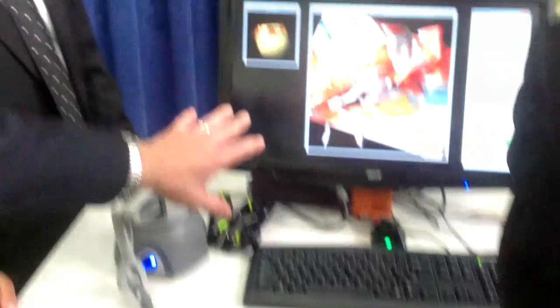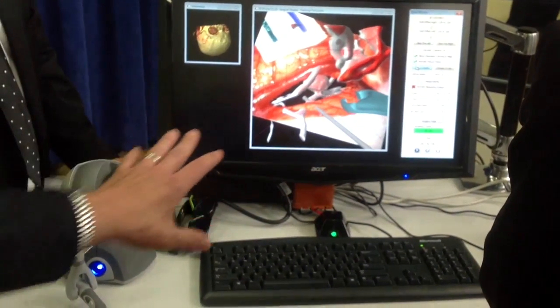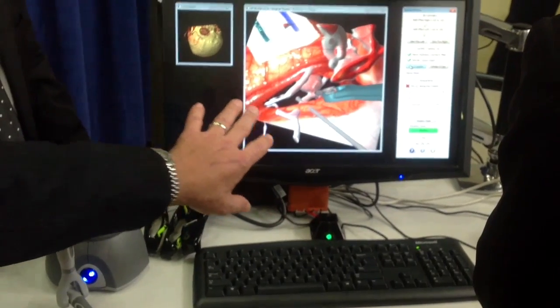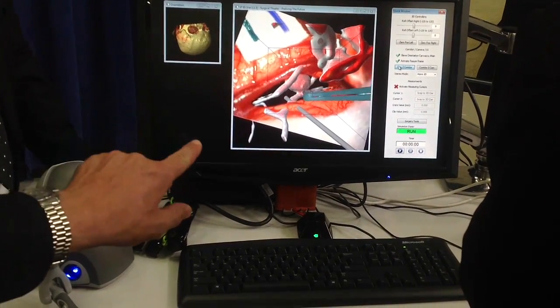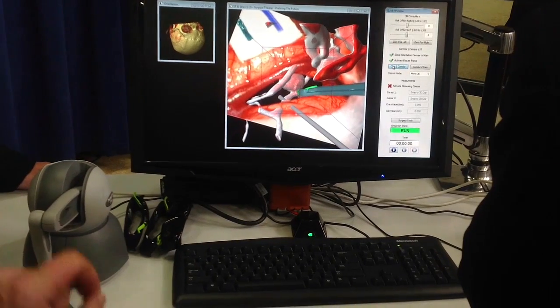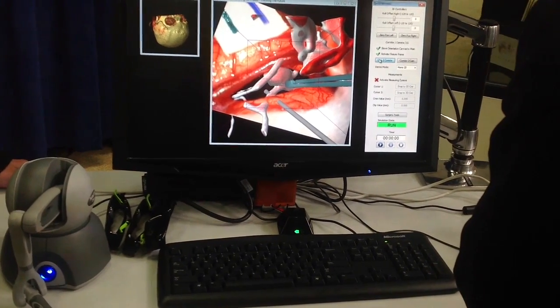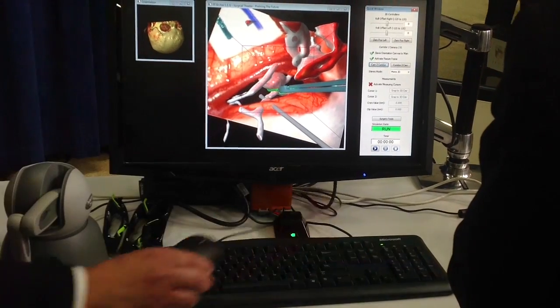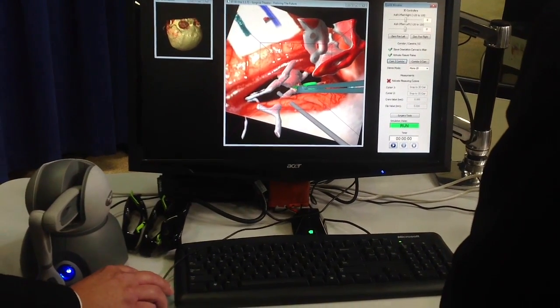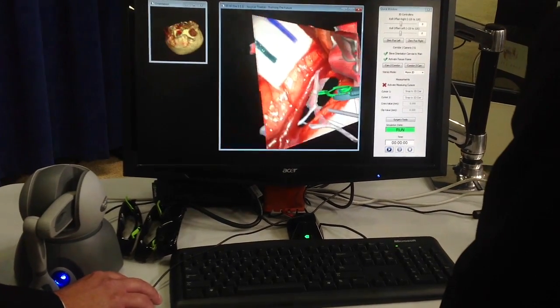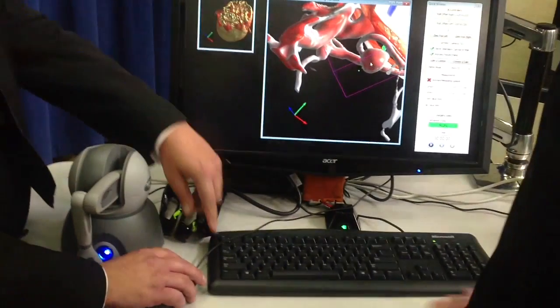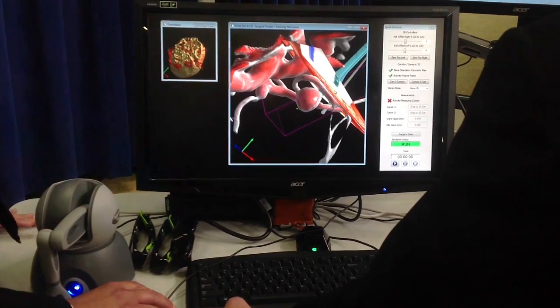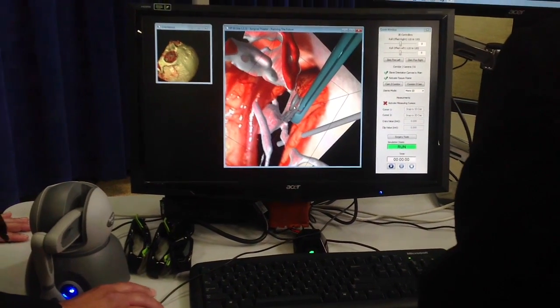And you can actually see — I don't know if you can pick it up on your camera — but you can actually see pulsations in the vessels. You can see the various structures, the windows, the optic nerve, the vessels, the branches, and you can actually manipulate the images. Once he's applied the clip, you can actually turn around and make sure that he's not only obliterated the aneurysm, but look and see what's going on with the perforators and make sure that we've not gotten the perforators. And if you do, then maybe you can take a different approach, try a different clip, or change your angle a little bit. And that's not something you can do using conventional technology.